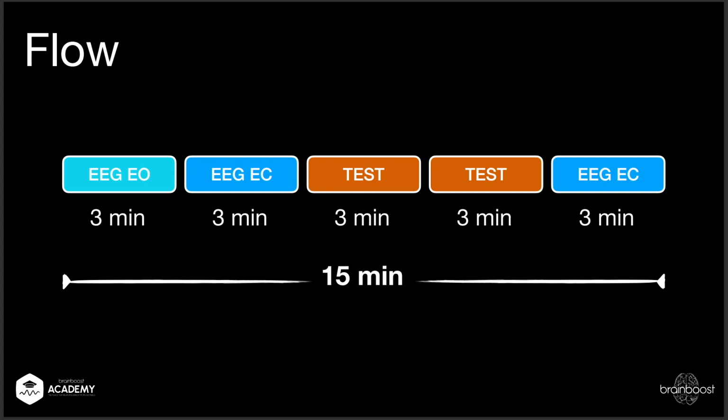So you do like anamnesis, say, hey, why are you here? What's up? Okay, here's an EEG cap, eyes open 3 minutes, and you just put this Xbox controller in your client's hand, and all instructions are on the TV. And if the client says, I'm not sure, then you could help, or you could say it should be sure. It says on the board. It's also some sort of test.